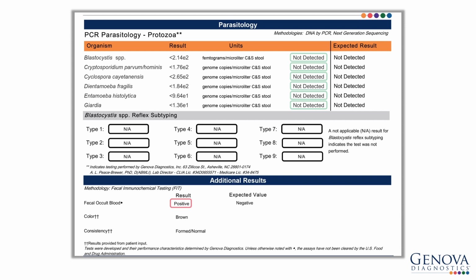Additionally, on this page, some practitioners may add on pathogenic bacteria if clinically indicated, and those are assessed via FDA-cleared enzyme immunoassay. These add-on bacteria include H. pylori, Campylobacter, Shigatoxin E. coli, and Clostridium difficile. These were not added on to this report because the patient already had these tests run 2 months ago at their local lab at the acute onset of her diarrhea.